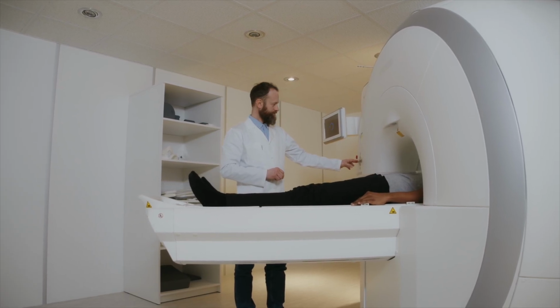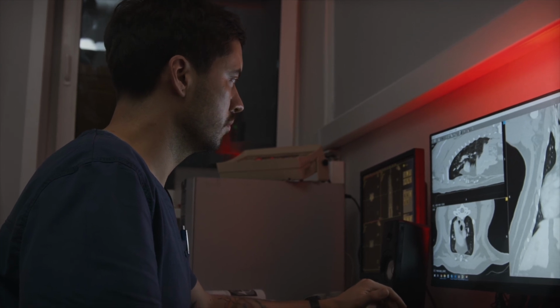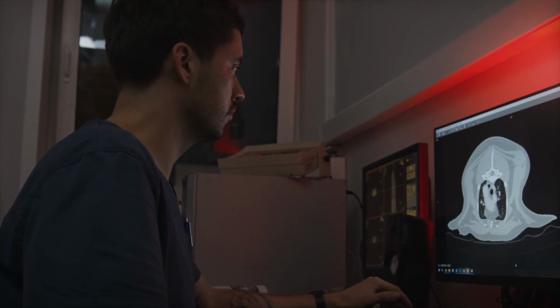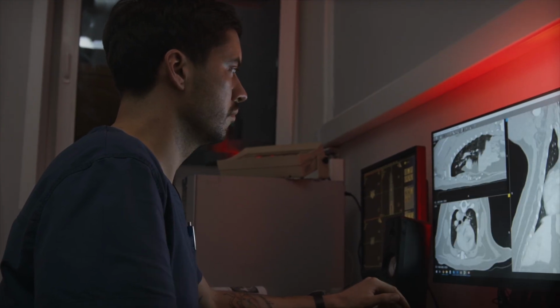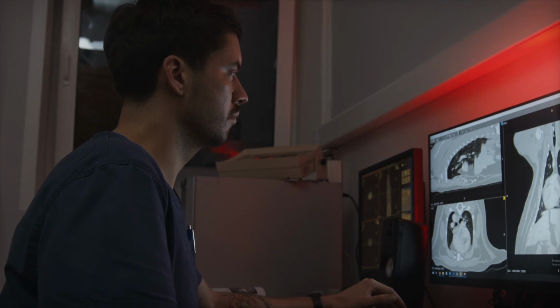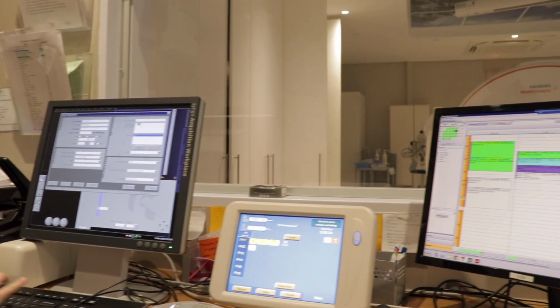Then when it comes to planning, before the patient goes for radiation therapy, for example, we have to come and plan here, do a CT scan for planning, so that they can do the same setup that we do here, they can go and do it there. For example, patients that have to be treated on the head, we have to make sure they are immobilized the same way they will be immobilized there. So we make a mask for them, and then we scan.